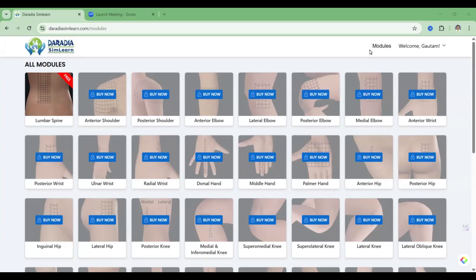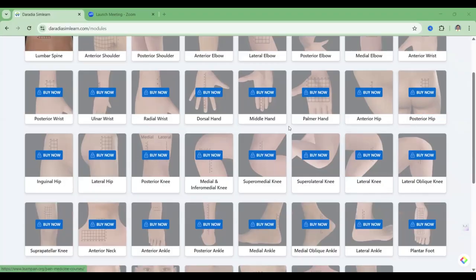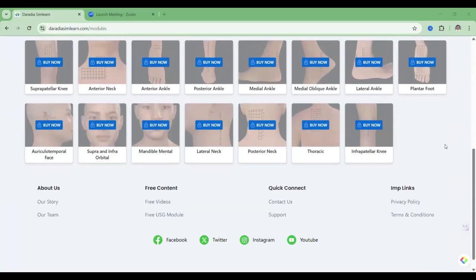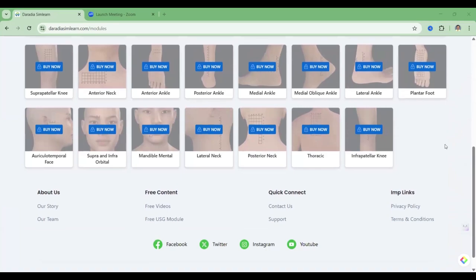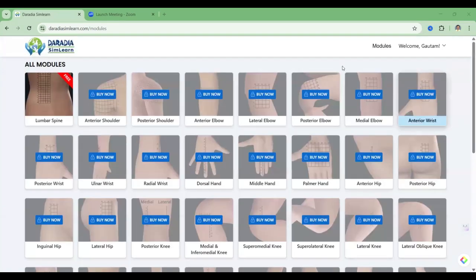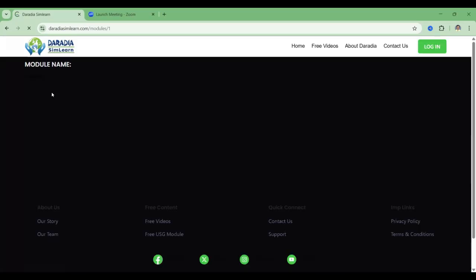Once you are logging in with your email ID and password, you will be coming to this screen. Here you see lots of modules are there. Some modules are locked — you can open them when you have the password. This lumbar spine module is free, so I am clicking on this lumbar spine module.